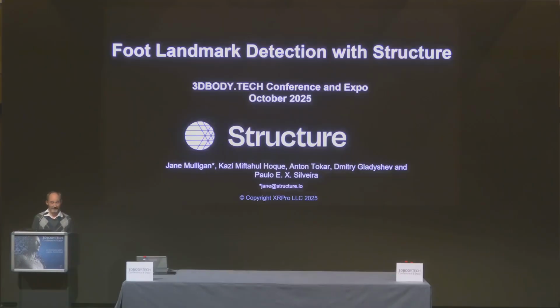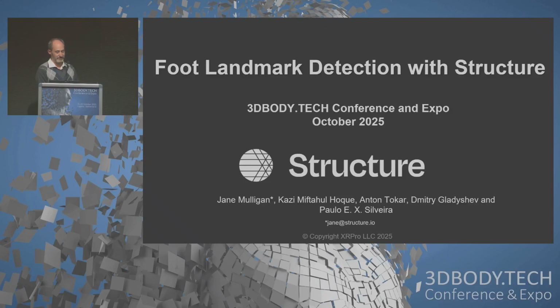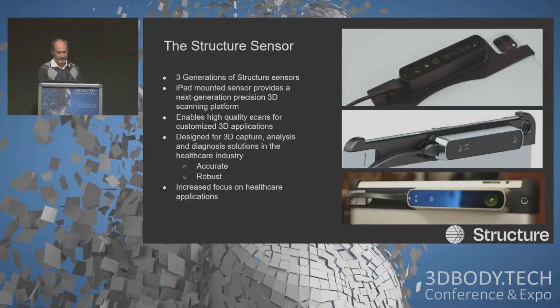Presenting on behalf of my first author, Dr. Jane Mulligan. I am the Chief Technology Officer of Structure, foot landmark detection with Structure. So the Structure Sensor, the latest one, the Structure Sensor 3, shown on top. They are usually iPad mounted, designed for robust and accurate 3D scanning, increasing adoption into healthcare applications, especially orthotics and prosthetics.